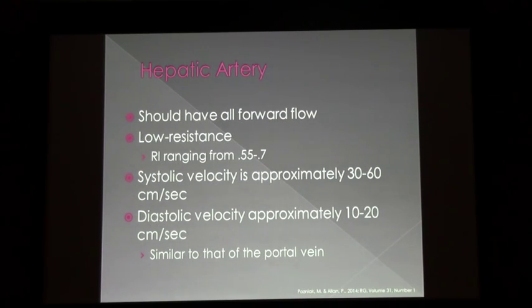Now, stenoses in the hepatic artery are not all that important unless you have a transplant. So that's where you come into play. Now, could we see something, or do something about it in a transplant? Yes, and for everybody else, it's probably no. So that's why we don't get crazy. But if you see something that doesn't look right, you've got a listing, yeah, you can come back and prove it.